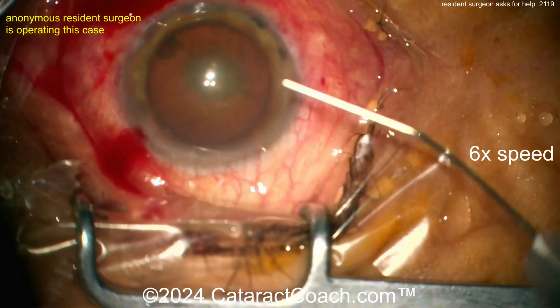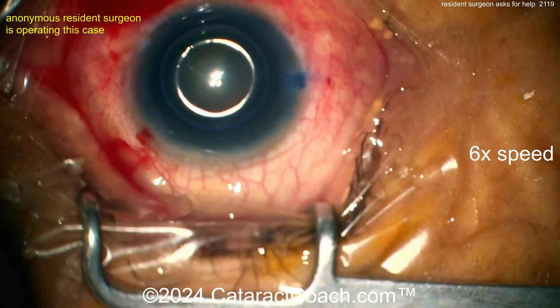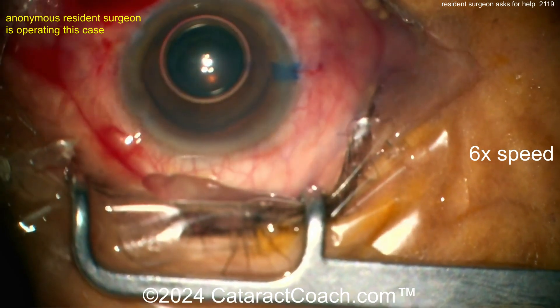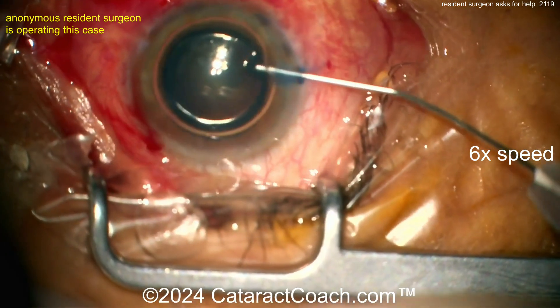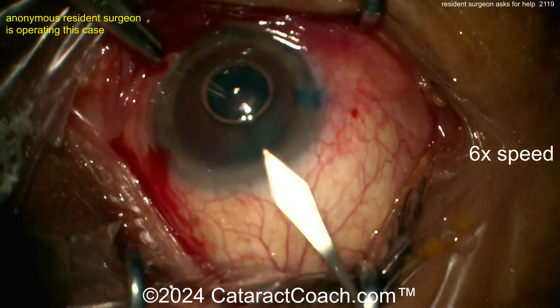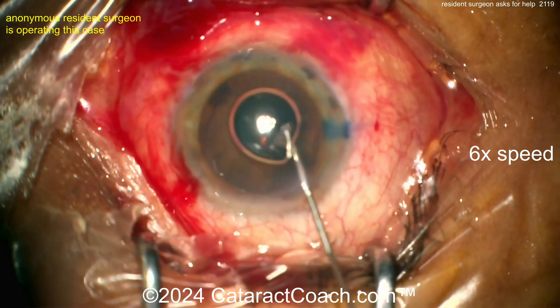First things first, you've got to get the focus. Why is this not focused? Why is the eye not in the center? You've got to center the camera, center the microscope, and get the eye in focus. That's important. I do appreciate you have good draping there — lash it out of the way. Now see the incision here? It's too avascular. The incision is too much in the clear cornea.